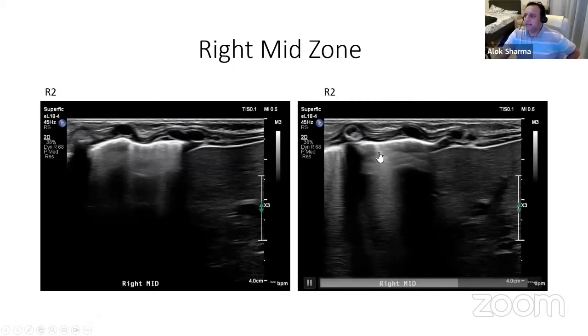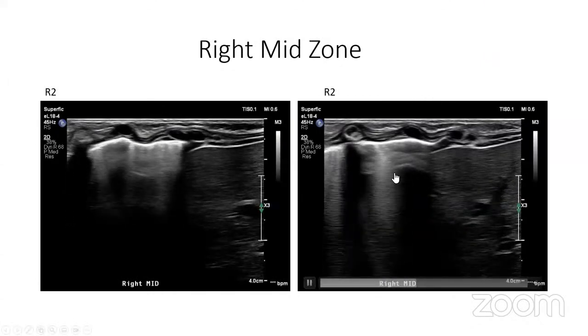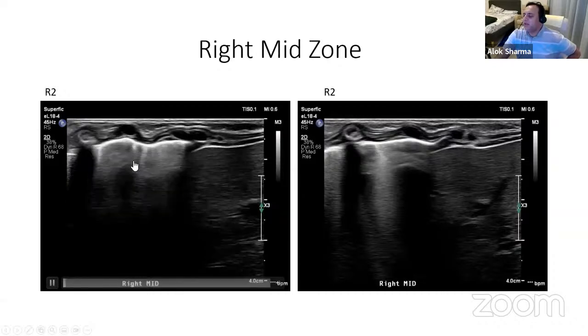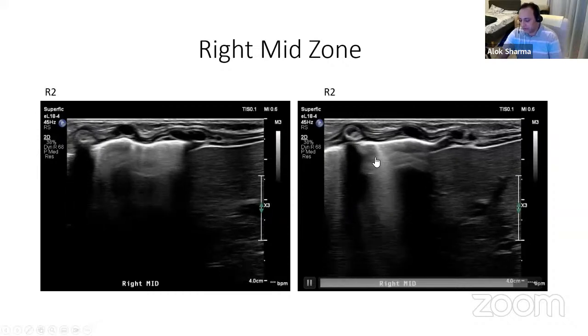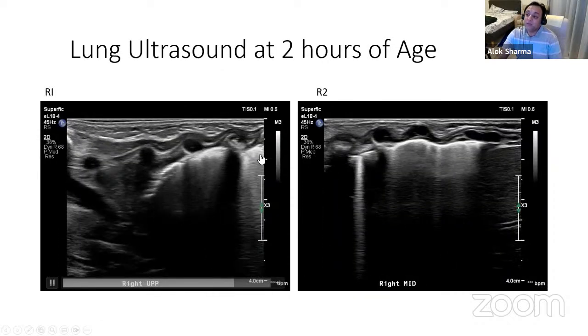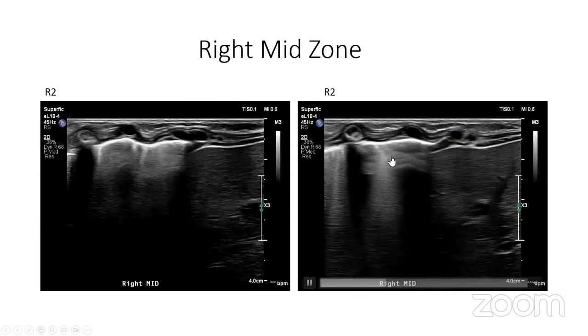Go with your gut. Absolutely fine. Maybe in the left side of the picture, there is some. Yep. And again, that's the reason for showing you the picture, that altering frequency. I'm not convinced we have any subpleural consolidations. And my gut feeling is when you see this image, I don't think these are subpleural consolidations either. So I think that's where you have to be very careful.